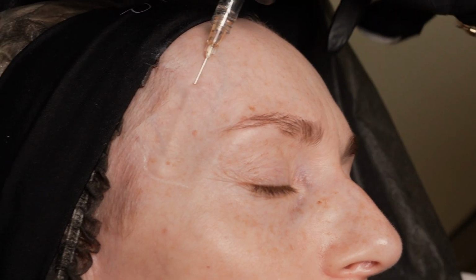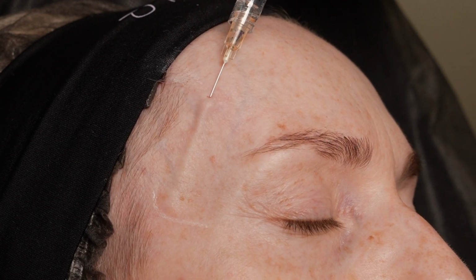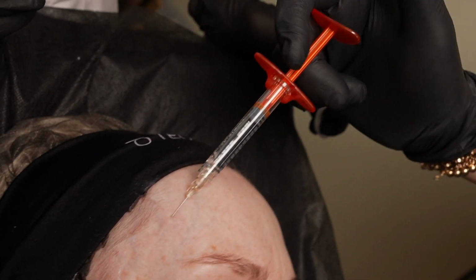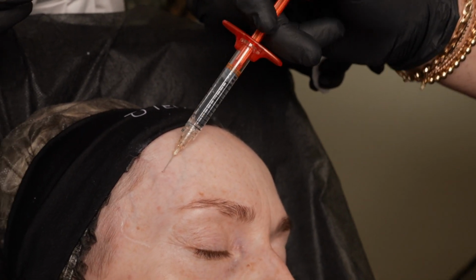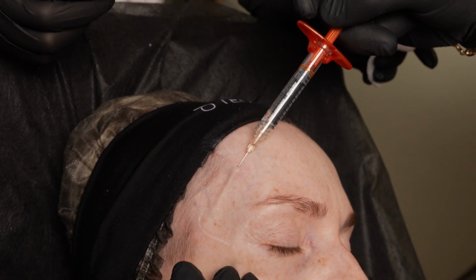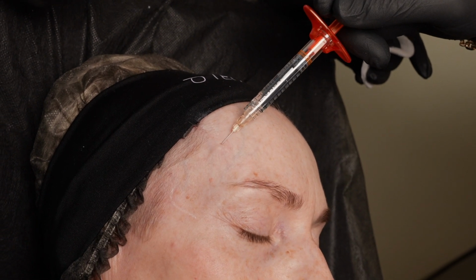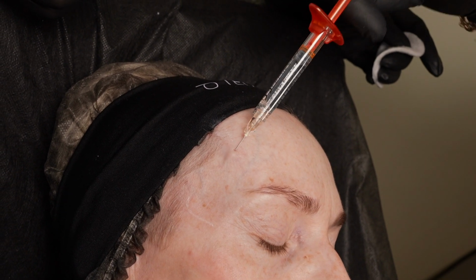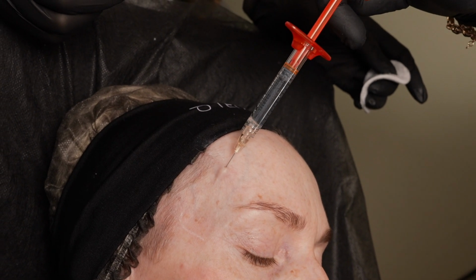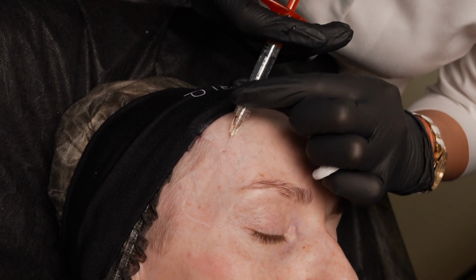When I do it like this, it looks superficial, but it's not that superficial. I can feel it. It's thick, hard to move. It lifts with difficulty. Exactly, this is not subcutaneous. In this patient, if it were subcutaneous, you could directly see all the details of the cannula. I can feel it, I think it's interfacial. Then inject a really small amount, retrograde.